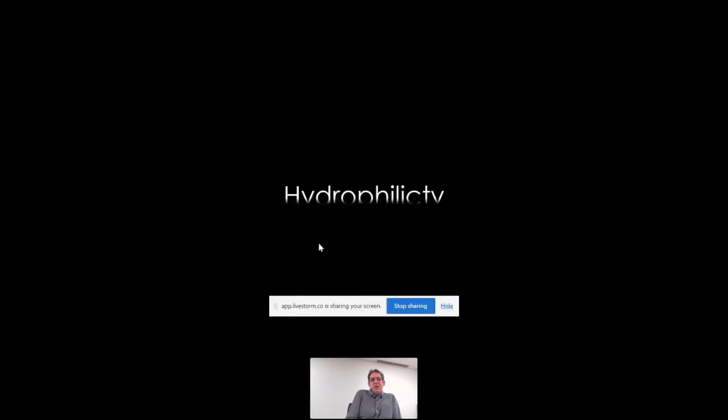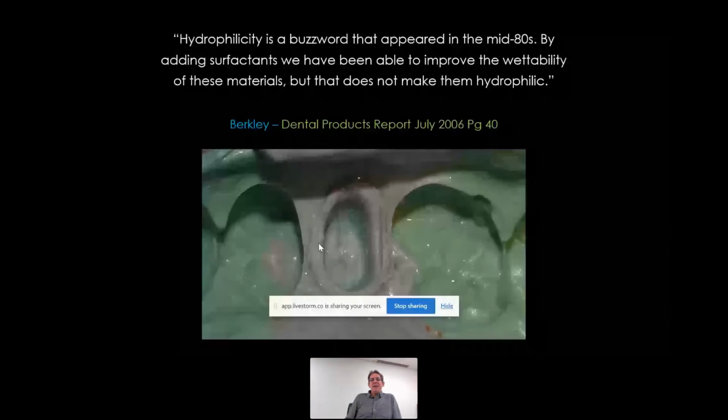So we're talking about hydrophilicity. Hydrophilicity is a buzzword that appeared in the mid-'80s. By adding surfactants, we've been able to improve the wettability of these materials, but it doesn't make them hydrophilic.